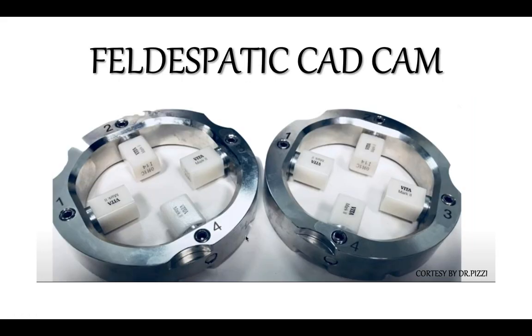Nowadays we don't have it in UF, but just know that we can also use feldspathic CAD/CAM blocks. It can be done in very thin layers, and it is easy, of course, to fracture because feldspathic is the one that has the highest amount of glass.